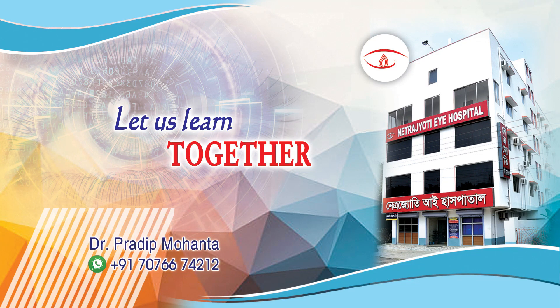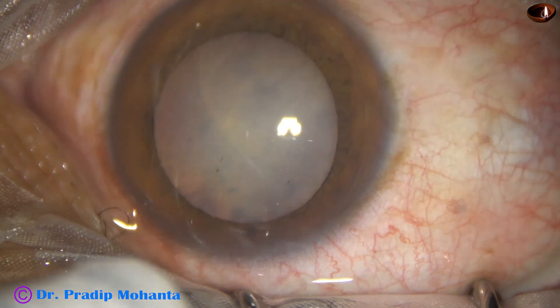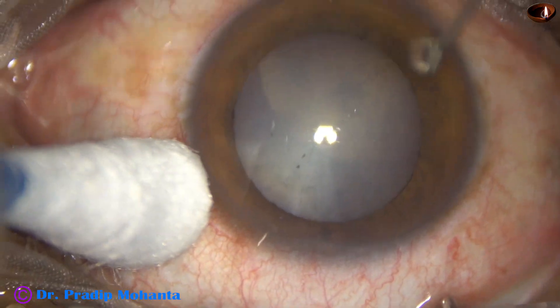Friends, welcome to my workplace at Ranaghat, West Bengal, India. This is a cataract in a silicon oil-filled eye. Let us observe this surgery.